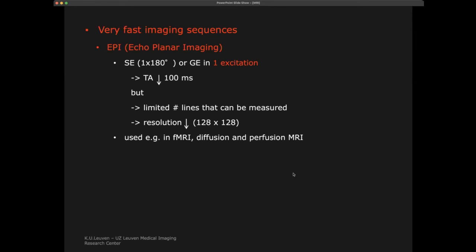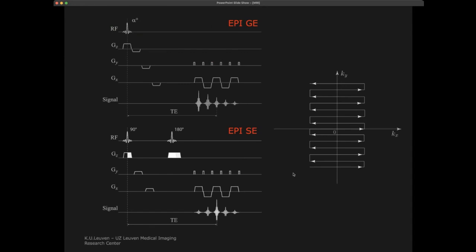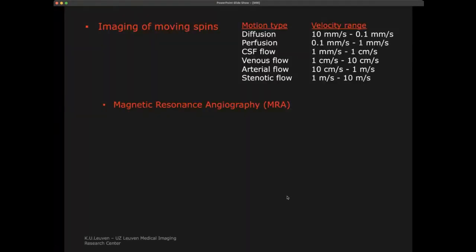But again, it doesn't matter. You don't need to know all these pulse sequences. You just need to know that there are different ways of doing it. That results in different ways of putting gradients and flip angles and things like that. It can become quite complex at some point, but again, this is not of that much importance.